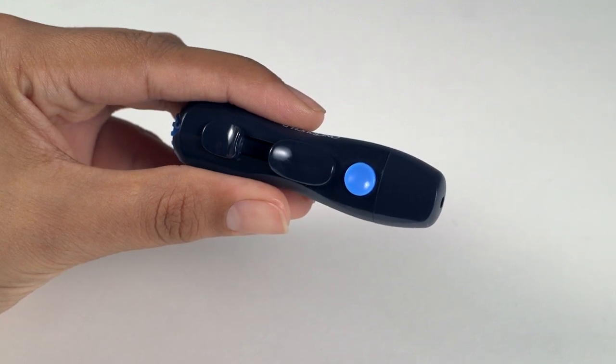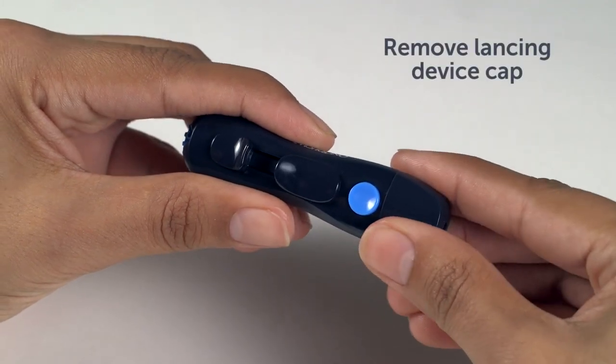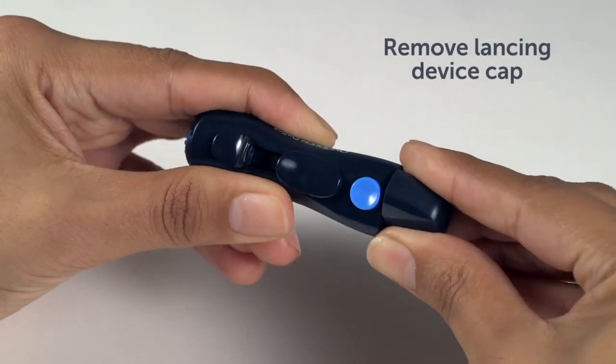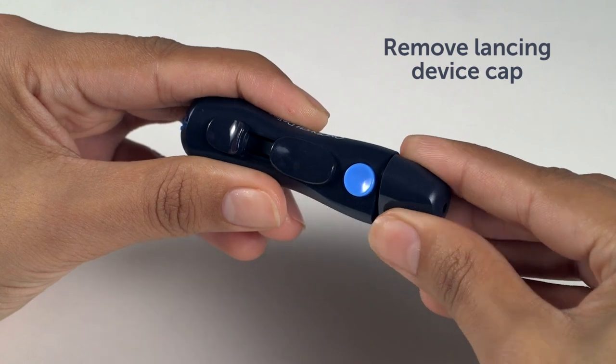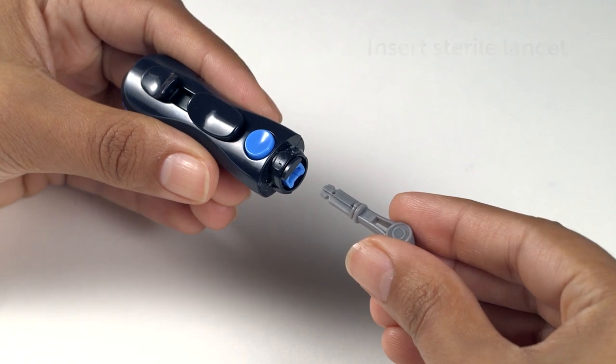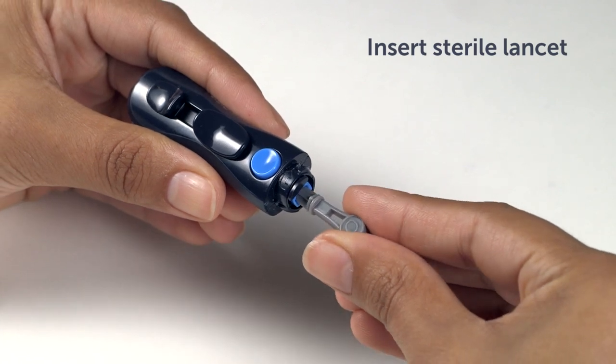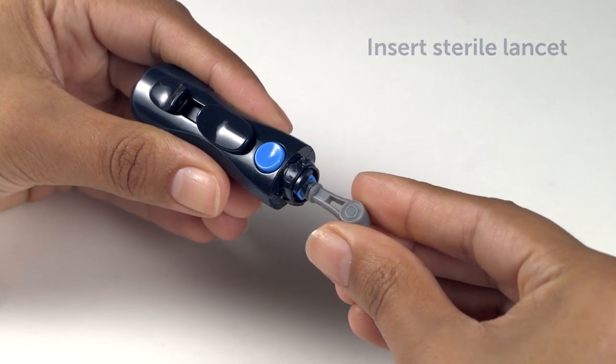To insert a new sterile lancet into your OneTouch Delica lancing device, first remove the cap by gently turning it counter-clockwise until it stops, and pull it straight off the device. Keep the cap to one side, as we'll need it again in a minute. Align the lancet as shown, so that it fits into the lancet holder. Push the lancet into the device until it snaps into place and is fully seated in the holder.